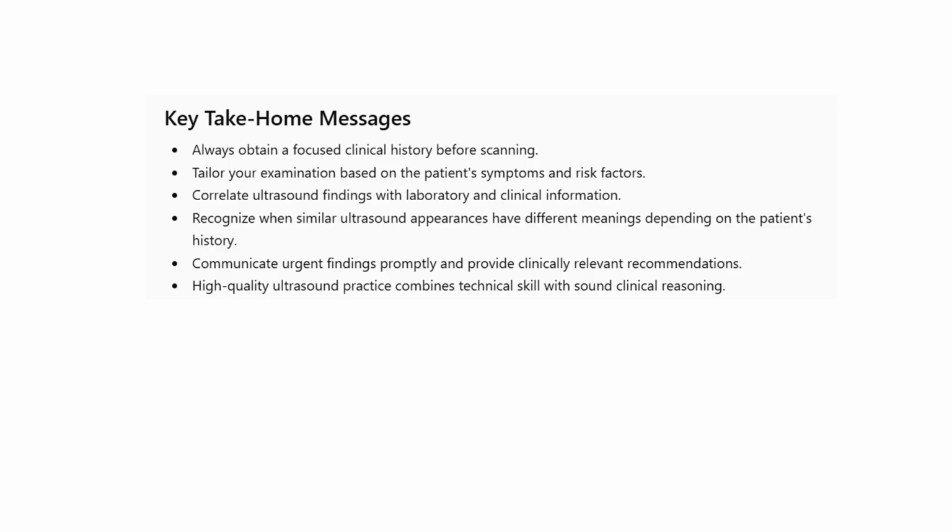So the key take-home messages to you, ladies and gentlemen: always obtain a focused clinical history before scanning. Tailor your examination based on the patient's symptoms and risk factors. Correlate ultrasound findings with laboratory and clinical information. Recognize when similar ultrasound appearances have different meanings depending on the patient's history, communicate urgent findings promptly, and provide clinically relevant recommendations. High quality ultrasound practice combines technical skill with sound clinical reasoning.